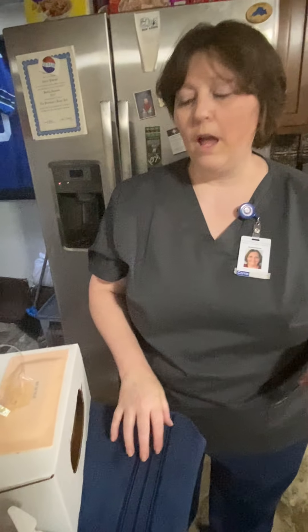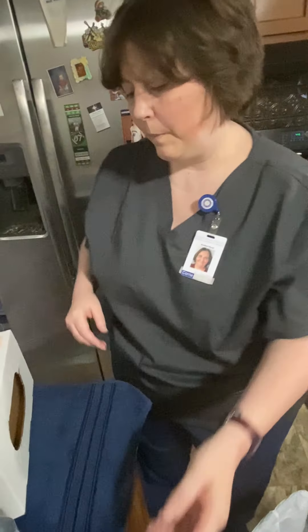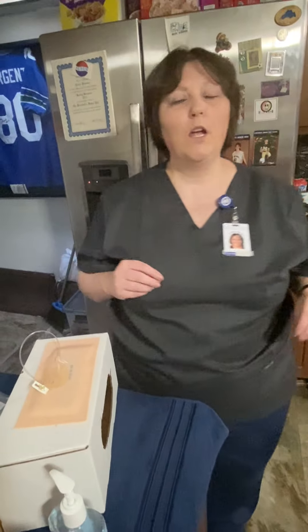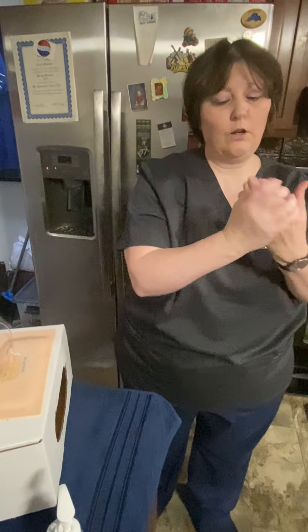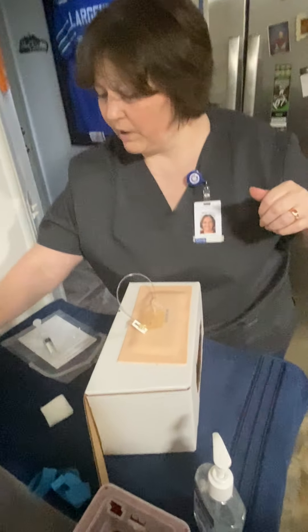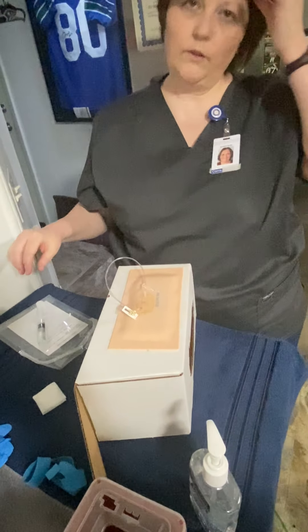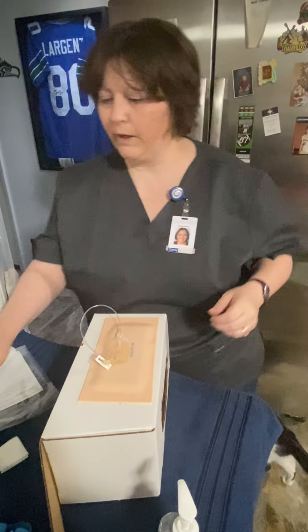Come in. Hi Mr. Peterson, it's your nurse Corey. I am here to remove the catheter — you're getting ready to go home, so I'm going to go ahead and take that out for you. Can you tell me your name and birthday? Kevin Peterson, 9/3/76. Perfect. We're working on your discharge orders right now. I'm going to provide for privacy and do hand hygiene, then get that catheter taken out. When the IV tubing comes out there is a little bit of bleeding, so I'm going to have you hold the gauze I give you for about 30 seconds, and then we'll check it.